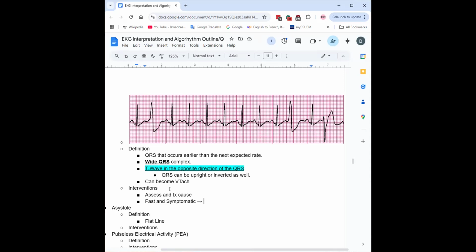This is to check if you guys are awake. I'm barely awake. Does that count? Fellas, not a trick question. Was it? Yeah, synchronized cardioversion.